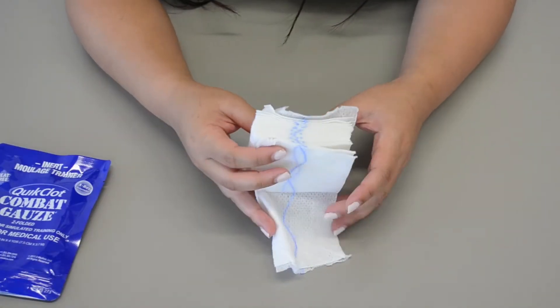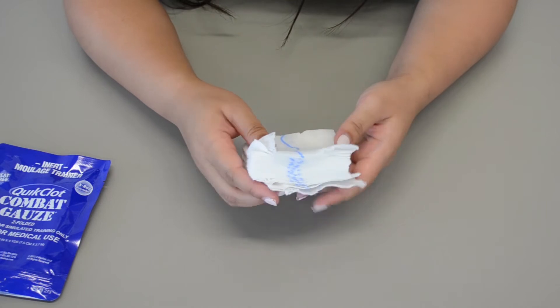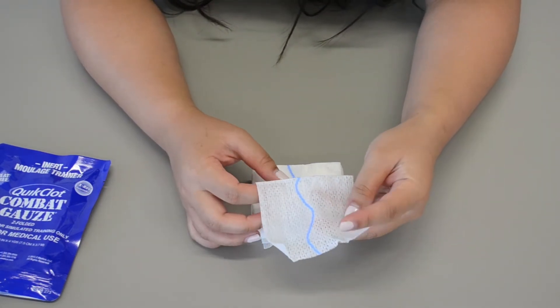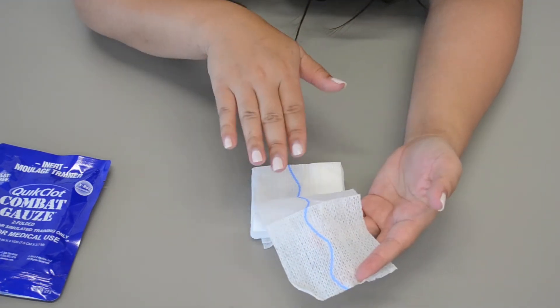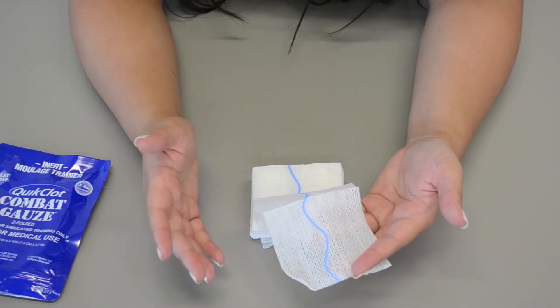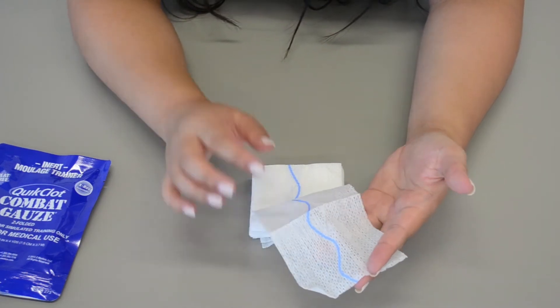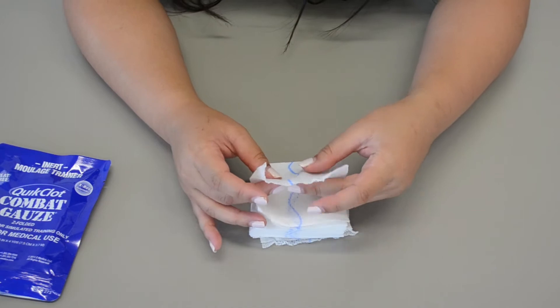These are impregnated with a hemostatic agent that promotes coagulation. This blue line right here is x-ray detectable — it is radiographic — so when a patient goes into the x-ray, medical professionals can see how deep the combat gauze was placed, and where the bleeding is, and all that good stuff.